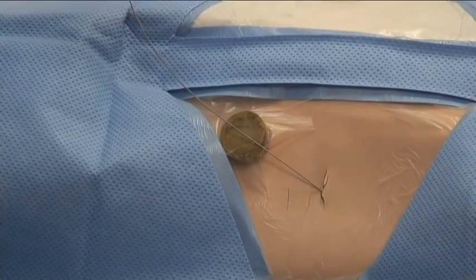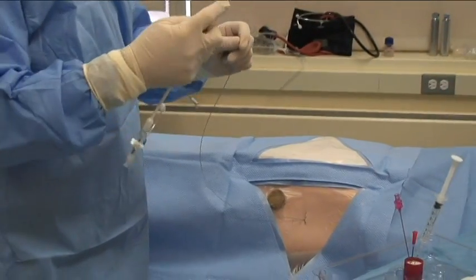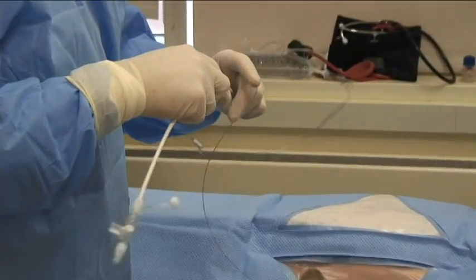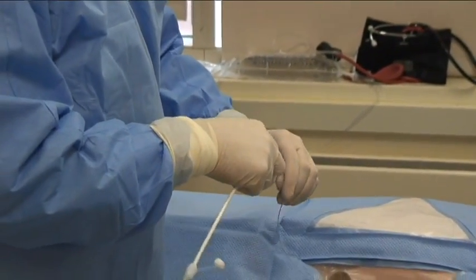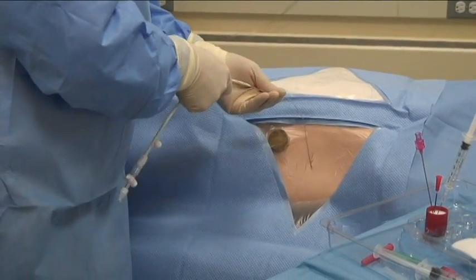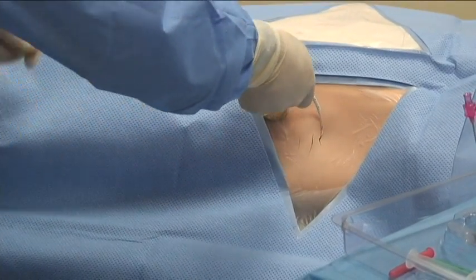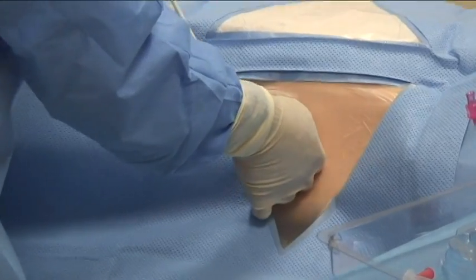At this point, we're ready to insert our chest tube. Now remember, the trocar is in place at this moment, keeping the catheter straight. Now I'm able to load this over the wire, as is the Seldinger technique. And you'd like to see the wire come out the other end so that you never lose the wire. So now I have the wire coming out the other end, so I know I'm in good shape. So I advance the catheter and get to the area I'm going in. So at this point, I can put the catheter into the chest space through my small incision.